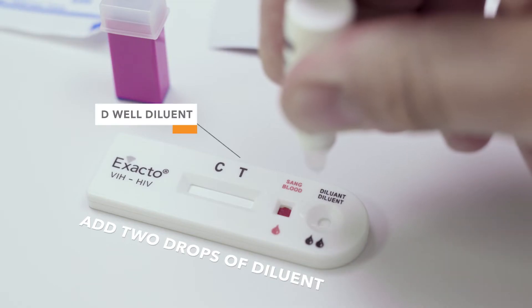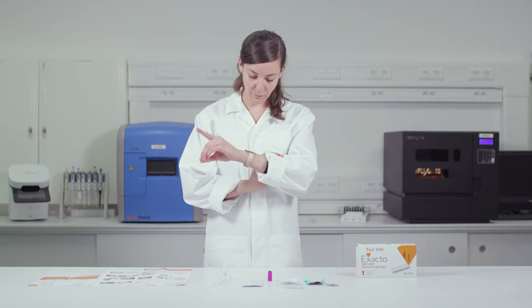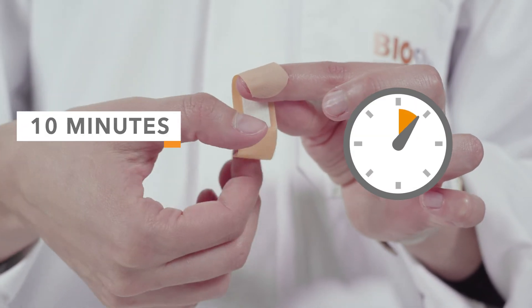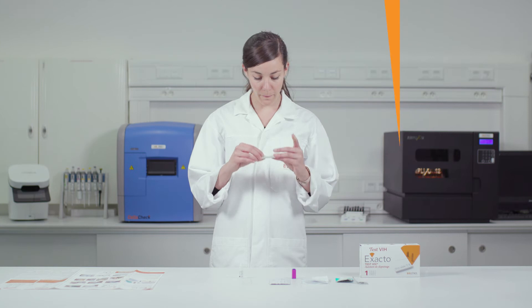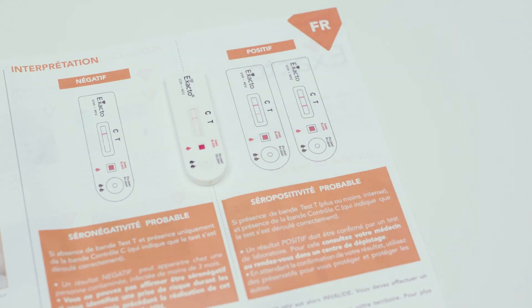Place two drops of diluent in the round well. Wait ten minutes for the results. During this time, apply the provided plaster on the area that was punctured. After the ten minutes are up, you can compare your results with the images provided in the instructions.